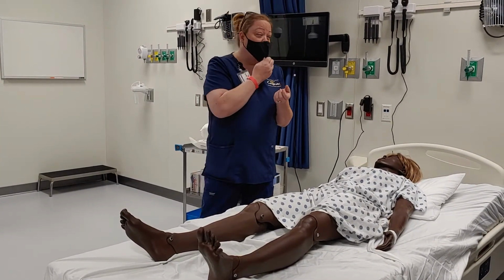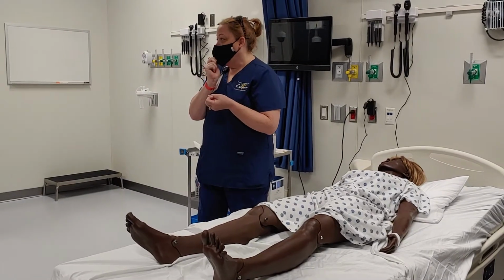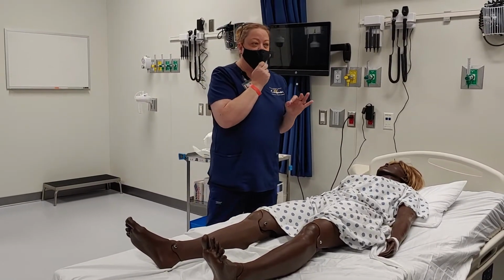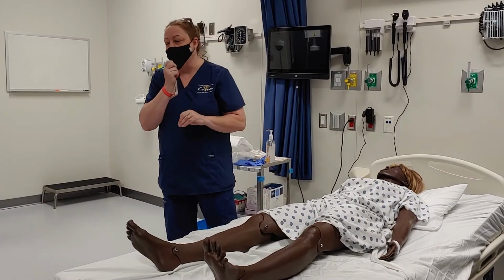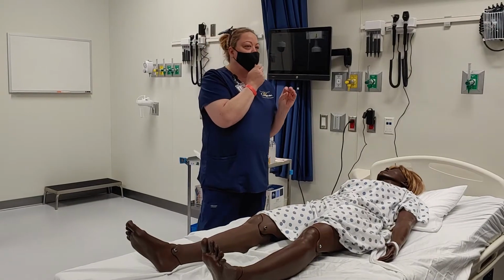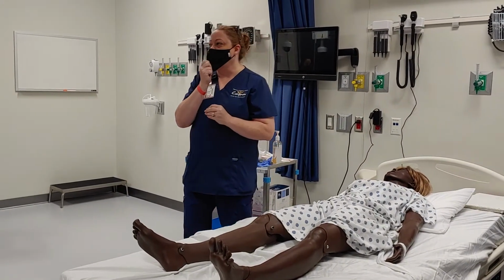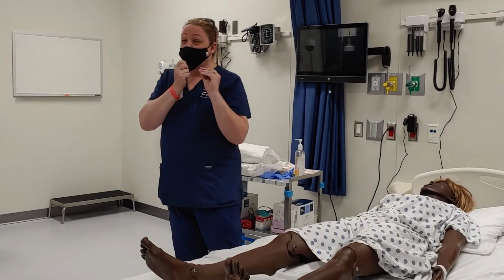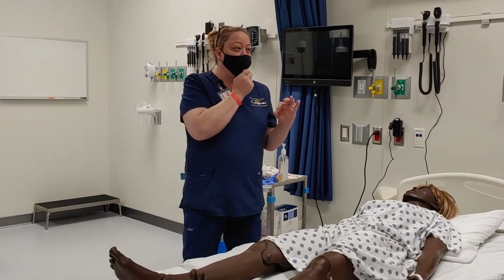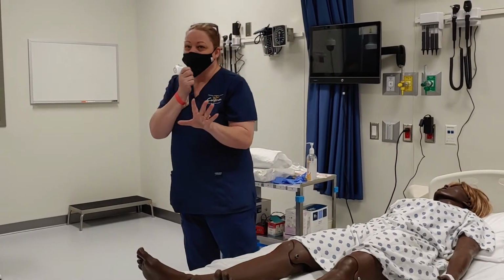Now, there's a couple different kinds of catheters, okay? So I want to make sure we are understanding the different kinds of catheters. The two main kinds of catheters, the first one is a straight catheter. Straight catheter simply means we are going to put it in, we are going to drain the bladder, and we're going to remove it. So it's not staying, okay?